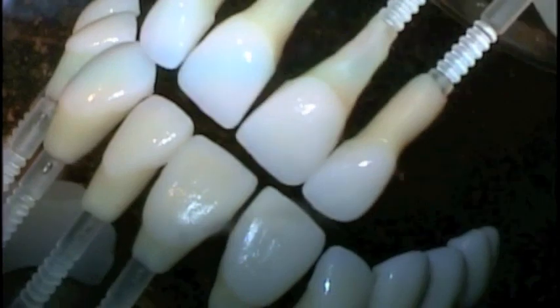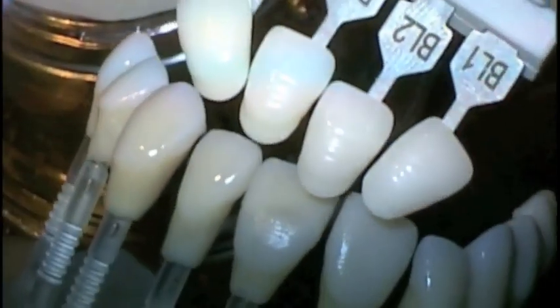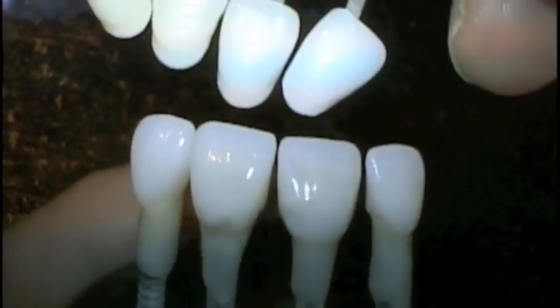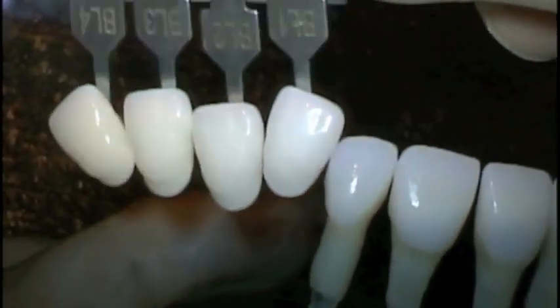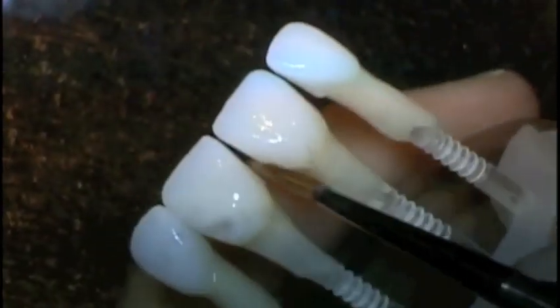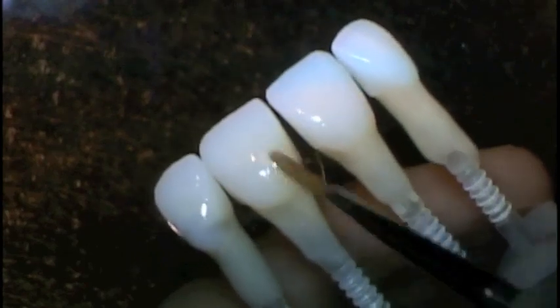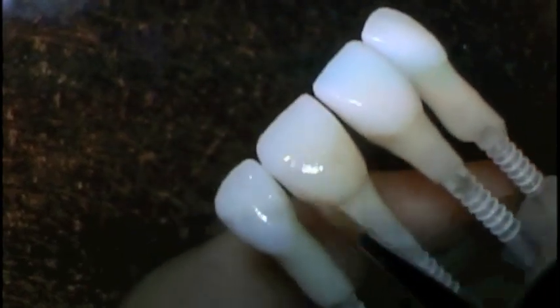Thickness here, 1.2 millimeters of opal 1, will have a lot different look than this other case that had 0.4 facial thickness. If we put the two side by side, we see the thicker restorations are much brighter than the thinner restorations. If we look at a shade tab, the thin restorations were BL4, the thicker restorations are more of a BL1 shade. Now we'll add a little bit of color gradient from gingival to incisal just by staining.